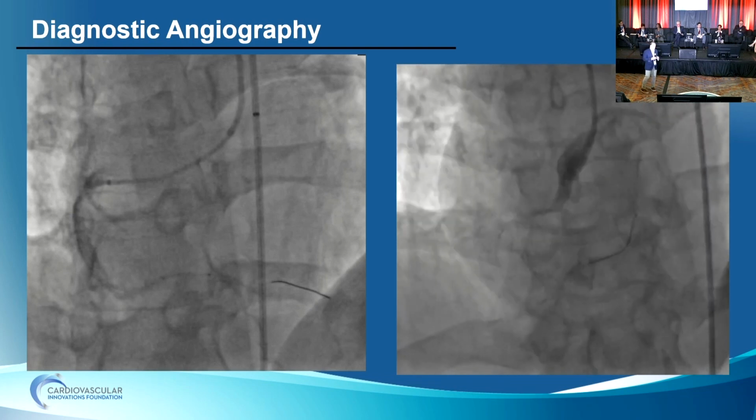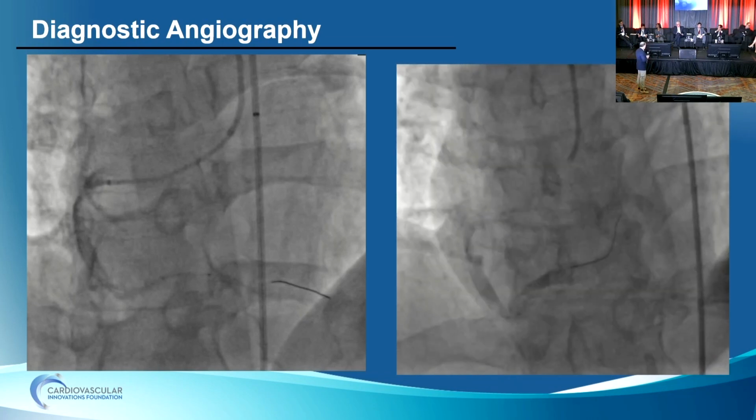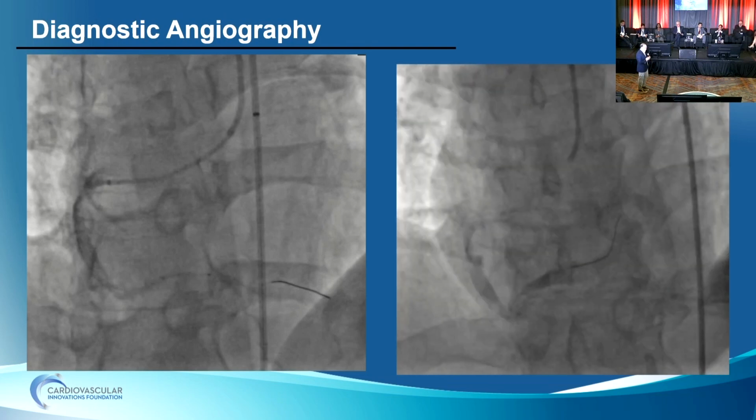And then there is this option, John, I don't know if people have done it, but there are these stroke stents that you put in the cerebral artery and then they can get big clots out. Yeah. I don't know if anyone has used it. We have a very good neurointerventional team, and I think if this were a daytime case, that might have been an option, but on a weekend it probably was not an option, but yes.